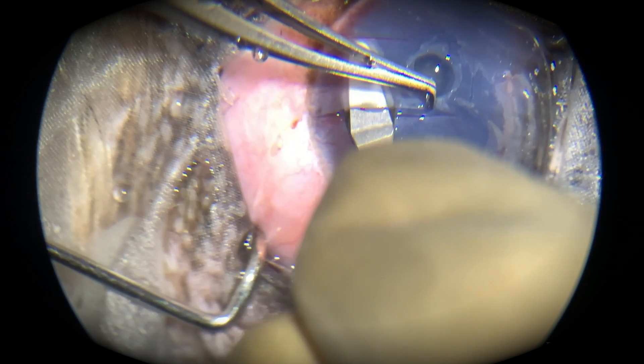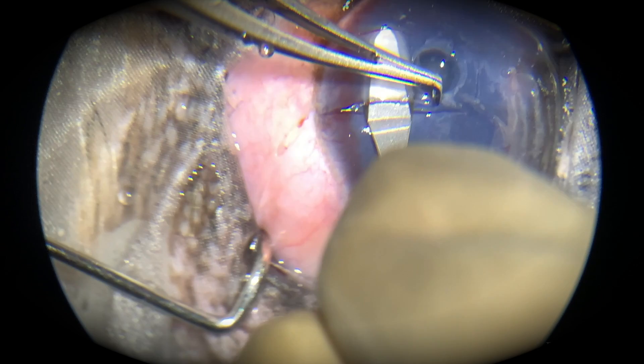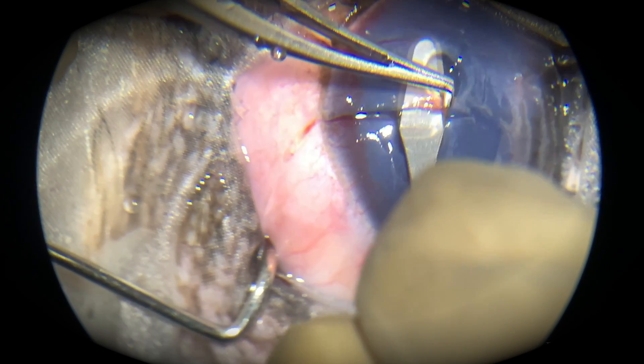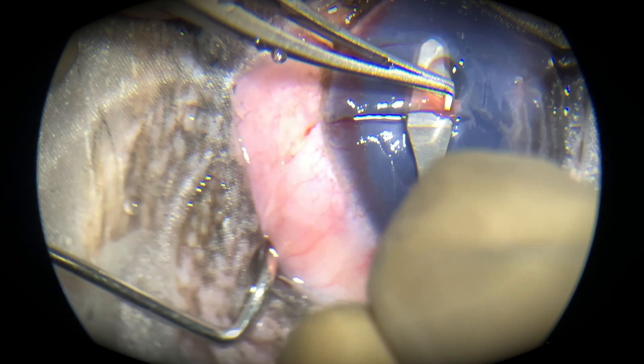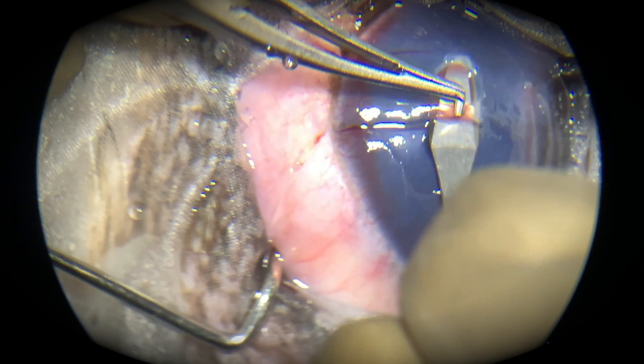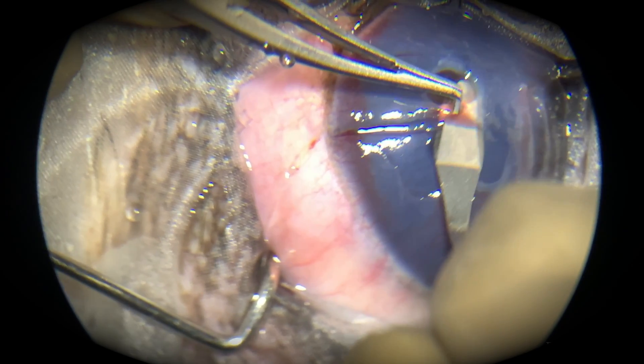What I'm doing is separating the cornea — this is half-thickness tissue, not full-thickness. This half-thickness corneal tissue is going to help us cover that desmetocele. Because we're using the dog's own cornea, rejection doesn't happen. You can see it slicing through that thickness very nicely.